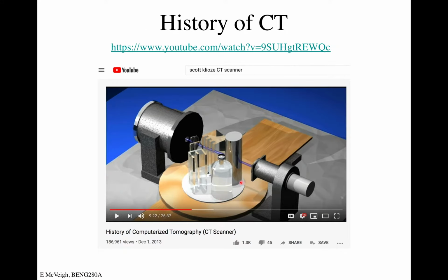And this is his original experimental device that he built at EMI with used parts around the lab. This is actually not an X-ray source. Inside this can is a radioactive substance that is just shooting out gamma rays and X-rays and all sorts of radiation. But he put a pinhole right here so that radiation was shooting out a hole right along here.